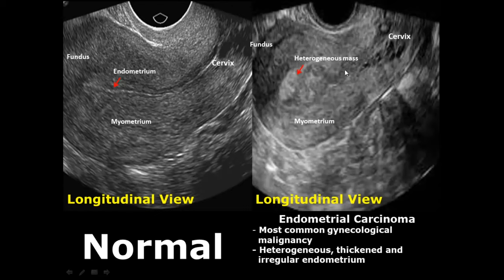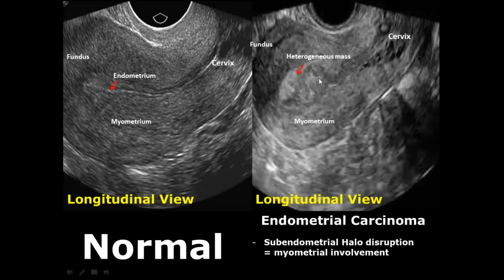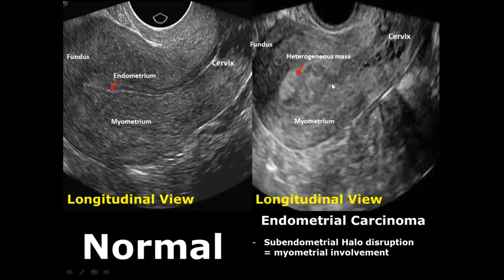Endometrial carcinoma is the malignant condition of the endometrium. It gives a heterogeneous appearance with thickened endometrium showing irregularities in texture. An important feature is disruption of the sub-endometrial halo — the hypoechoic area in the innermost layer of the myometrium right behind the endometrium. Disruption of this halo in endometrial carcinoma indicates myometrial involvement, meaning the carcinoma has reached the myometrium.